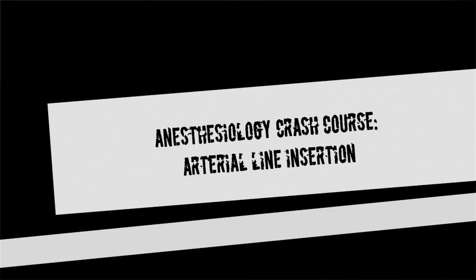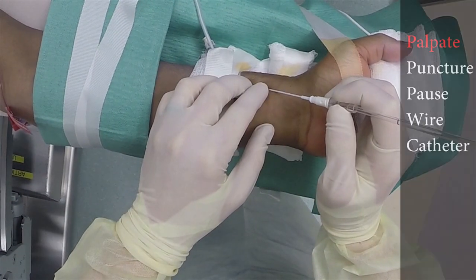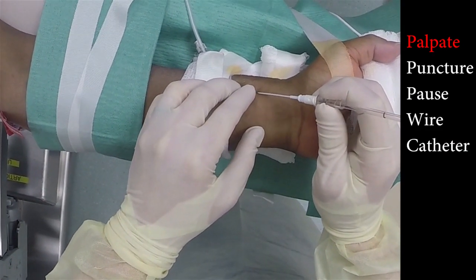This is an introduction to arterial line placement. This is an easy procedure to perform. Let's watch the ease and quickness with which this can be accomplished.